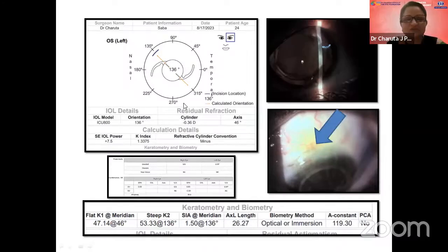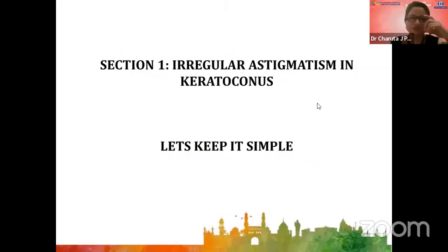And we had obviously counseled the patient that she would have a refractive surprise. I planned a sclerocorneal tunnel incision in order to create a surgeon-induced astigmatism of 1.5. And then at the end, this is her last follow-up. You can see there is a piggyback IOL of the toric IOL along with a sphere of +2. So altogether, post-op day 1, she was 6/9, and now 1 month post-op, she's 6/6 partial. I'll come back to this case later on. This is to say that the grapes are not sour.